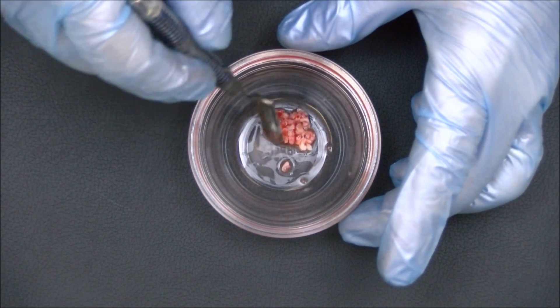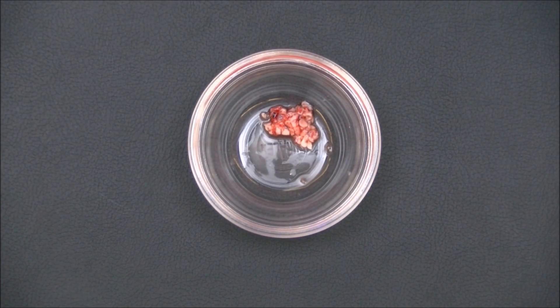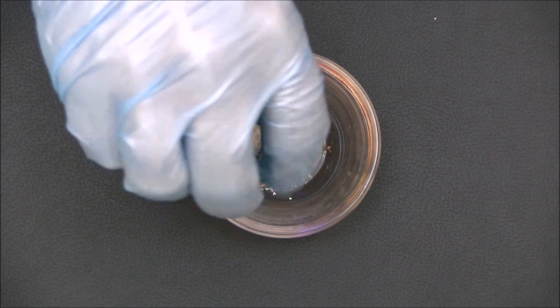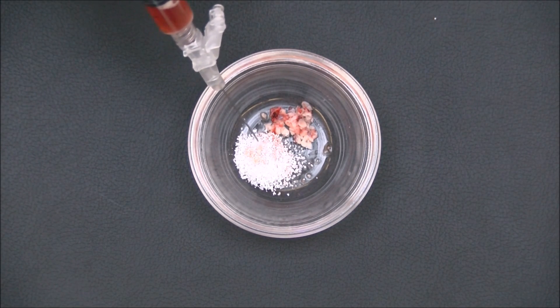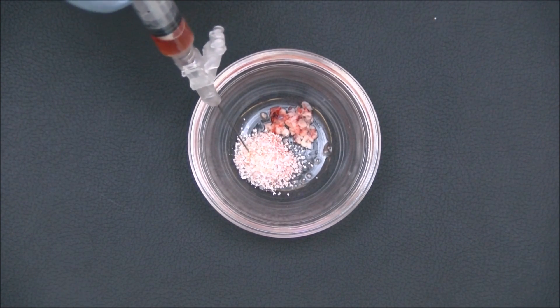The morselized PRF is then placed to the side of the dappen dish, and the bone graft material of your choice is added. To improve its handling characteristics, the bone graft is hydrated with the serum harvested from the bottom of the collection tray.